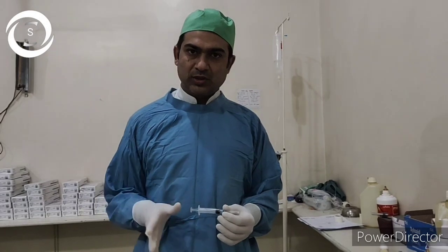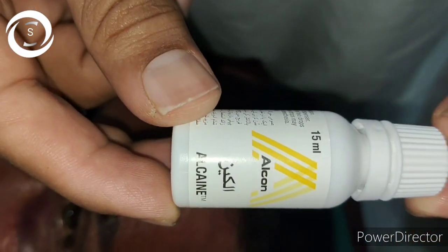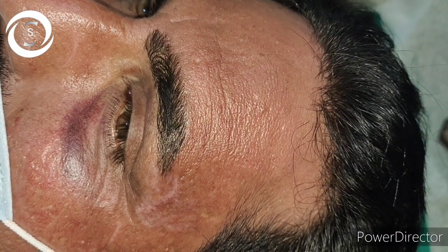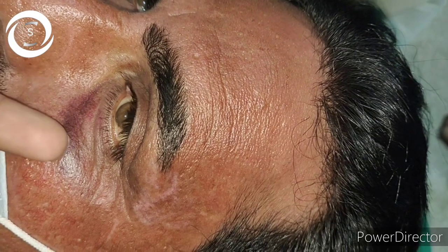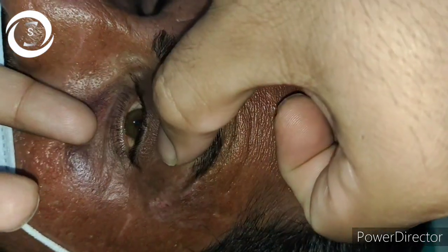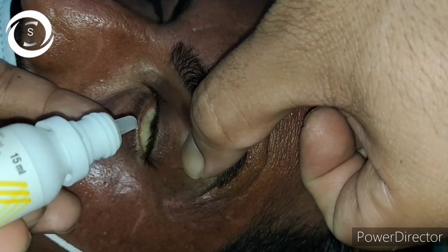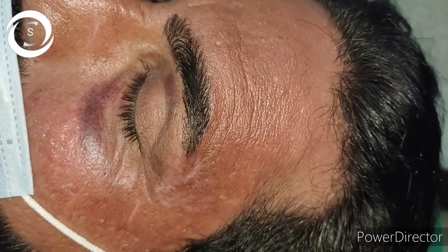So let's start. Now it looks like a very easy and simple method, but it has grave consequences if you don't perform it under aseptic situation, because it is associated with the grave complication of endophthalmitis. So in this video I have tried to show you the best possible technique, or my technique, to decrease the incidence of endophthalmitis.